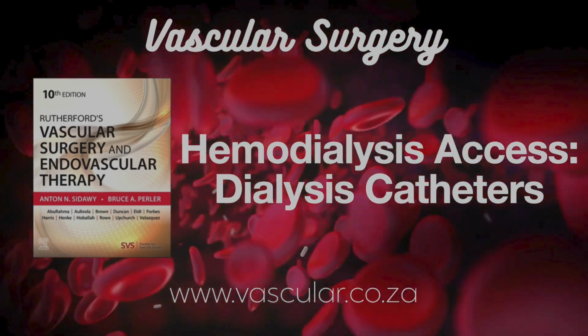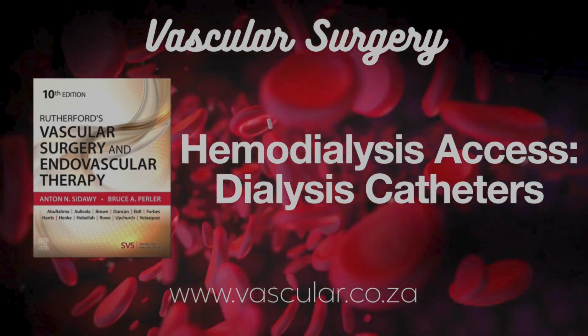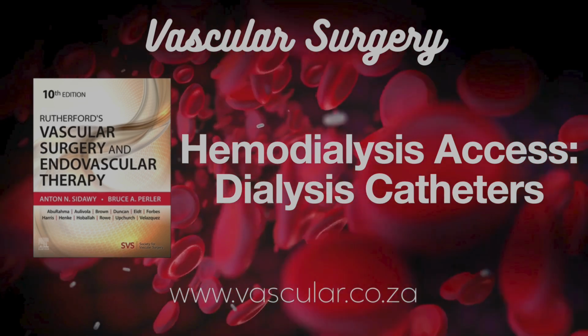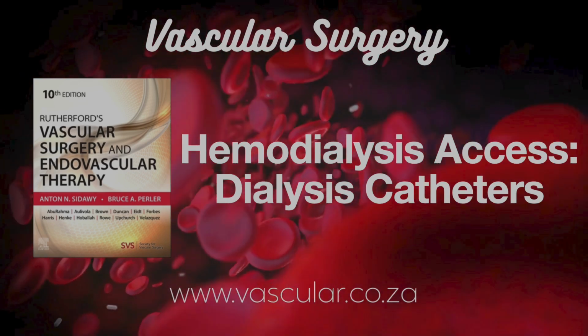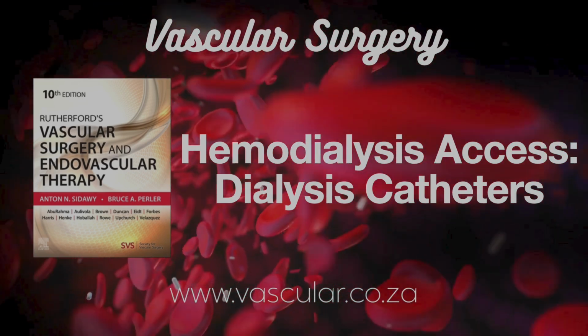And the scariest one, cardiac perforation. Very unlikely with today's soft catheters, but possible with the stiff wires or dilators. If it happens, you can get cardiac tamponade, blood filling the sac around the heart, squeezing it. How would that present? Rapid shock, patient looks blue, neck veins bulging, fast heart rate, muffled heart sounds. Chest x-ray shows a big globular heart.